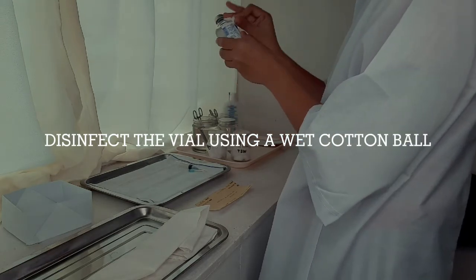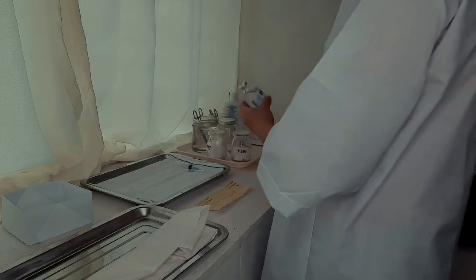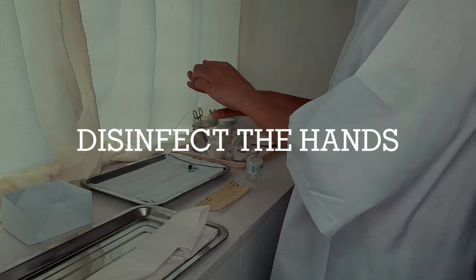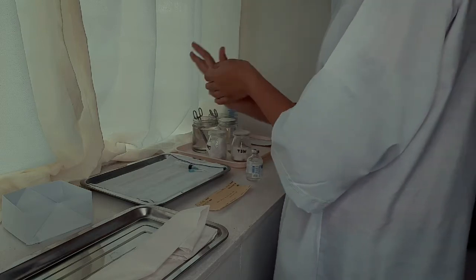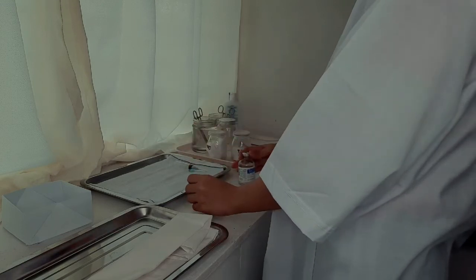Disinfect the vial using the wet cotton ball. After disinfecting the vial, also disinfect your hands. Next, do the second reading. Sterile water, sterile water.